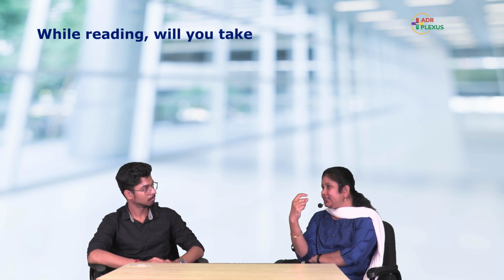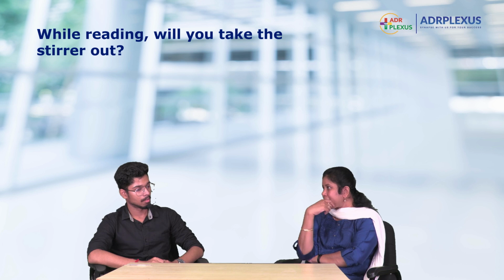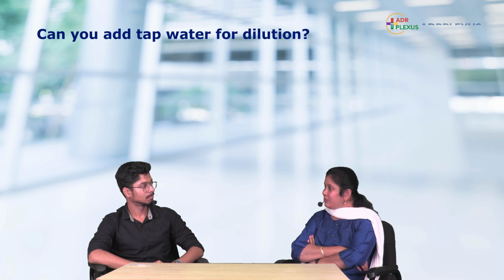After you add the distilled water drop by drop, you will have to mix the contents. There will be a stirrer provided for mixing. Will you read the graduations with the stirrer inside, or will you take it out? We'll take it out, ma'am. Very good.